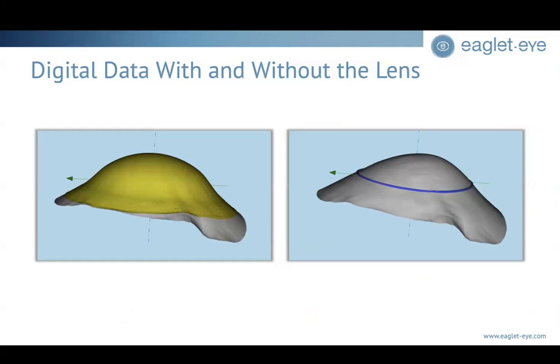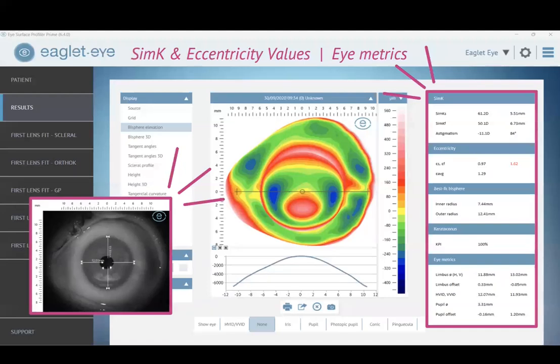This is the same patient and what the lab was able to generate, although we decided to bring the patient back. It really highlights the cool aspects of using digital software to collect data, map out the eye, and create empirical lenses based on that data that are very, very accurate and true to the shape that we see in the clinic when the lenses come in.